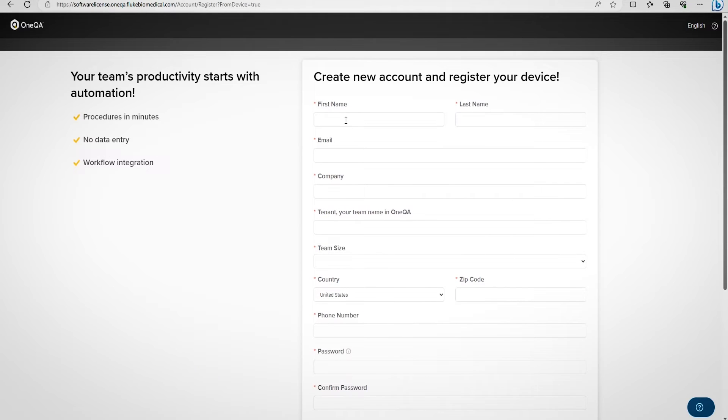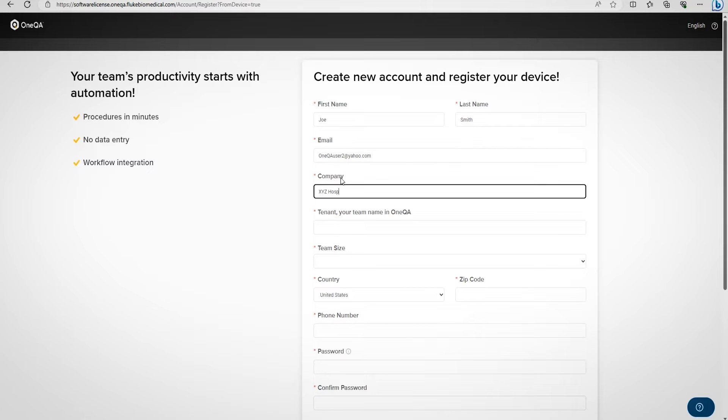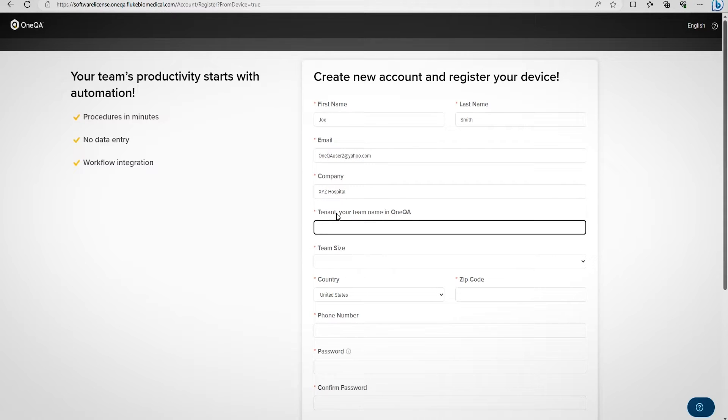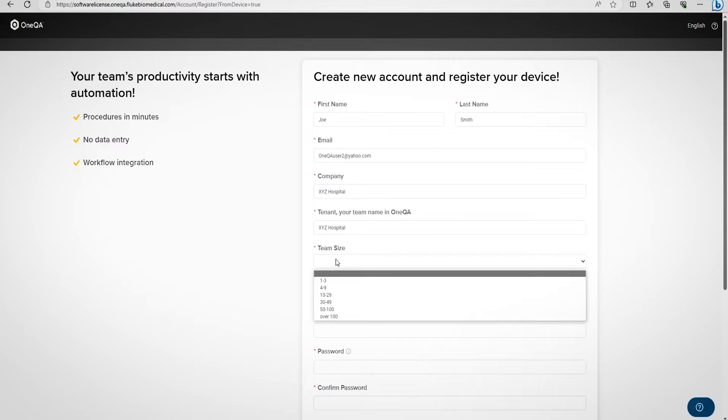First, enter your first and last name, email address, company name, and tenant name. The tenant name should be the name you want to use for your account within OneQA. Many customers prefer to use the name of their hospital or organization.